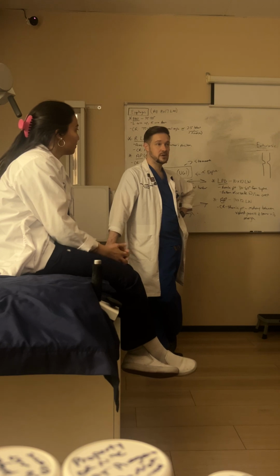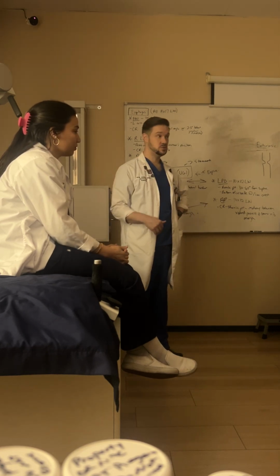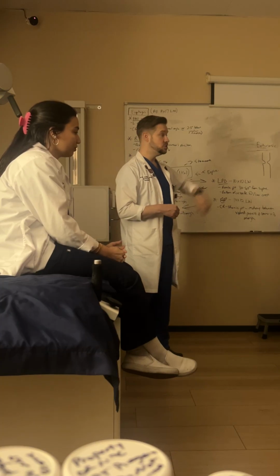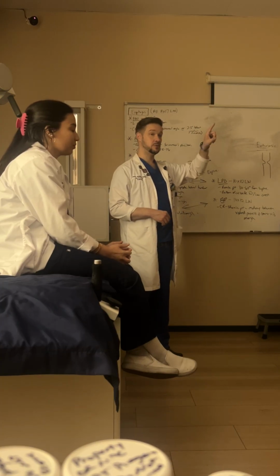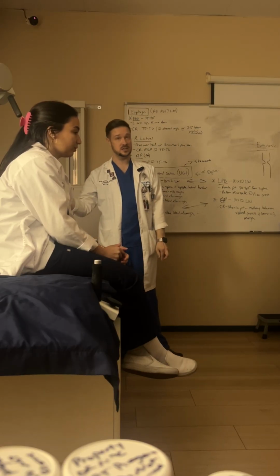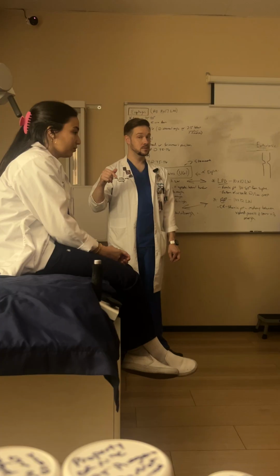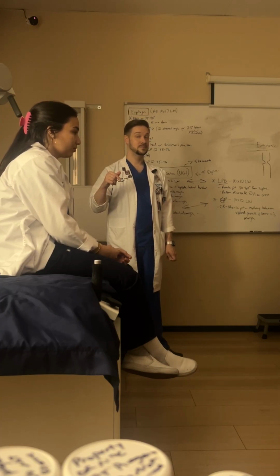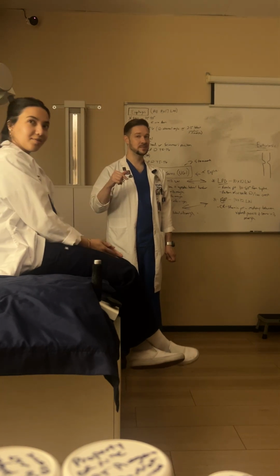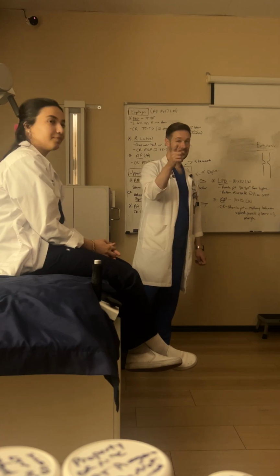And for order of operations, here's a pop quiz critical thinking question for you. If you had a patient who was going to get their entire GI tract evaluated with barium, would you do the upper GI small bowel follow through first and then the enema, or would you do the enema first and then have them come back to do the upper GI small bowel follow through? I would say the bottom one, the second one you said. Yeah, why? I'm not sure why, but it just makes more sense. Just to ensure that there's nothing else hanging out down there. Good guess. Come on, April.